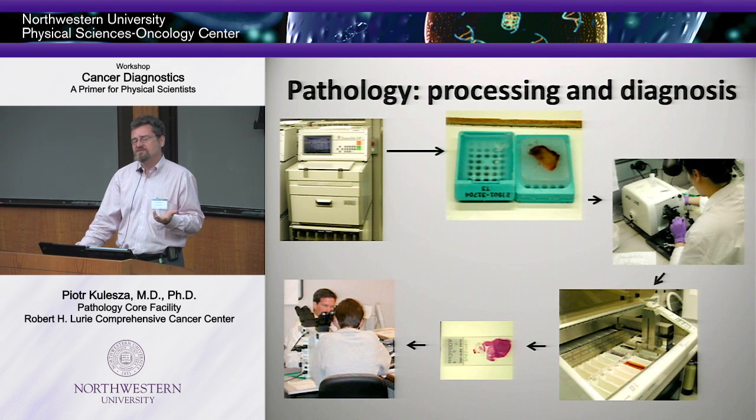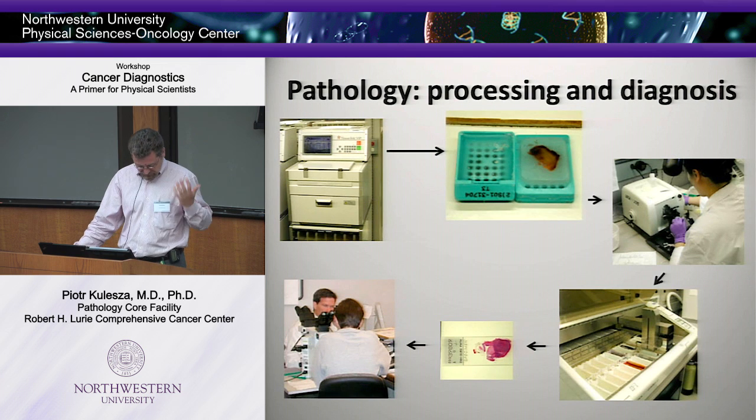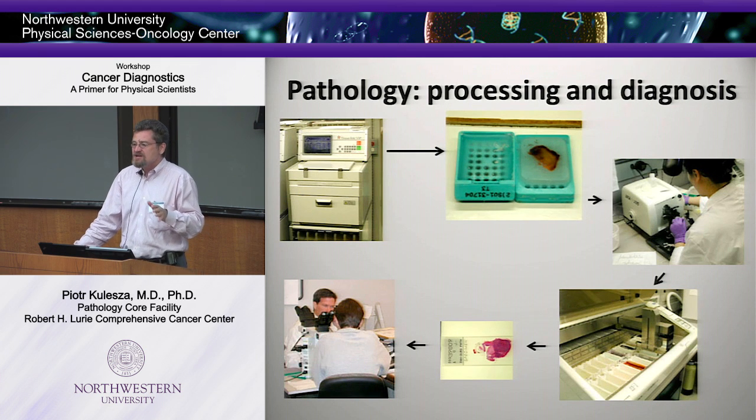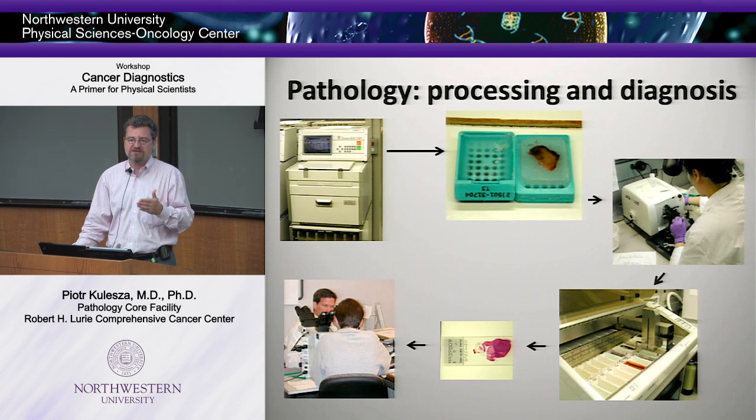What you've heard, you must have, is hematoxylin and eosin, which is the H&E stain. That again is something that I probably look like, an H&E stain, you know, red and blue, and the other colors are utterly unimportant. So this allows us to see the cells, to see the structure of the tissue, to know where the collagen is, where the cell borders are, where the nuclei or the subcellular organization, as well as the architectural aspects of the tissue, are based on an H&E stain.